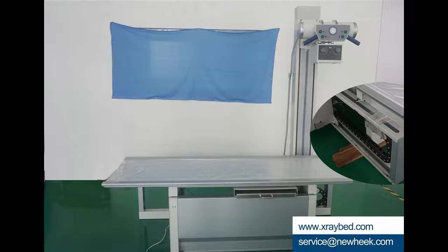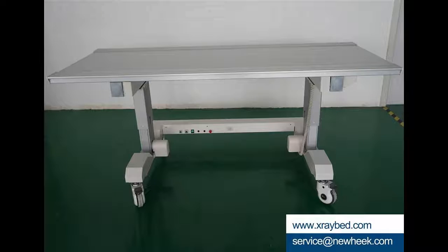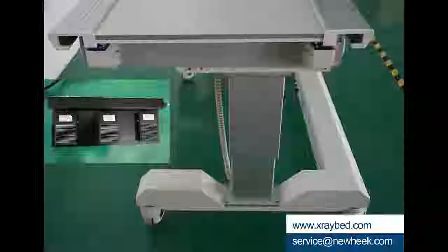Newheek has the X-ray table that fits perfectly with the U-arm. The NKT-2 X-ray table material mainly comes in three kinds: density plate, plexiglass, and carbon fiber board. Different materials require different prices — details can be consulted.